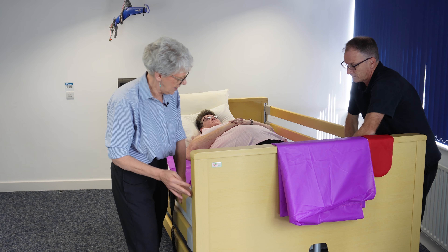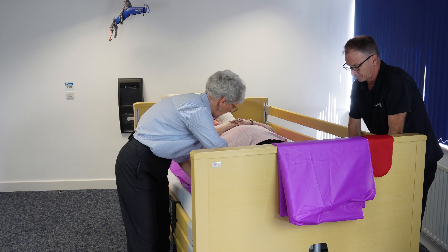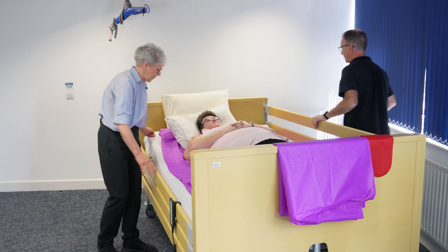I'll just make sure that the slide sheets are underneath nicely, and then we're ready to go.